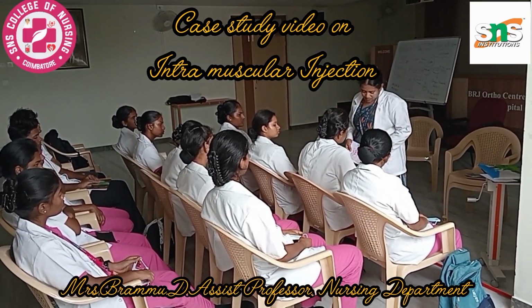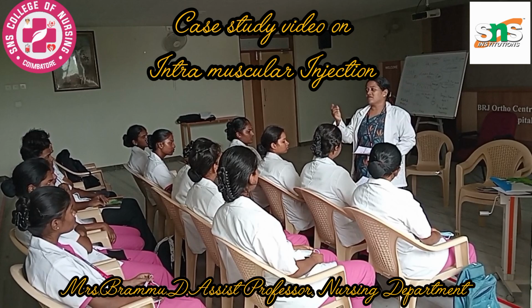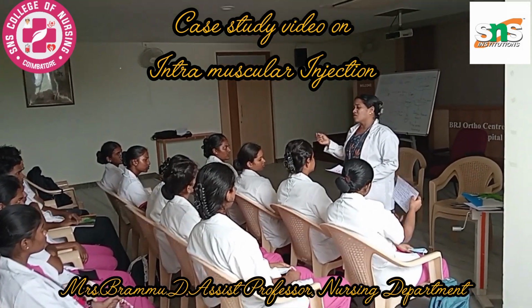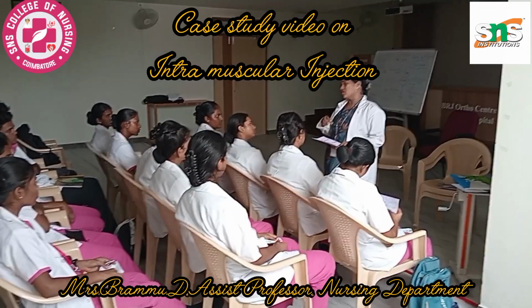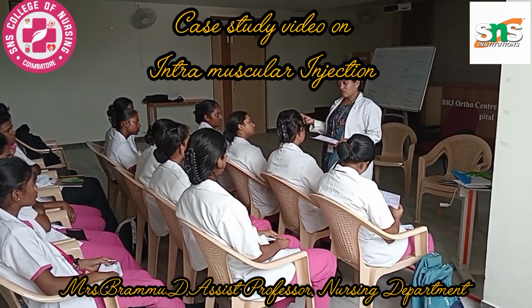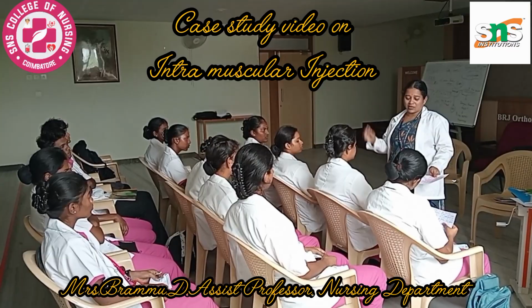So dosage and amount of medication, correct equipment. The doctor is ordering only 1 ml, so you have to take only half of the medicine from the ampule, not the full dose. According to the dosage order, you are going to dissolve and prepare the medicine.